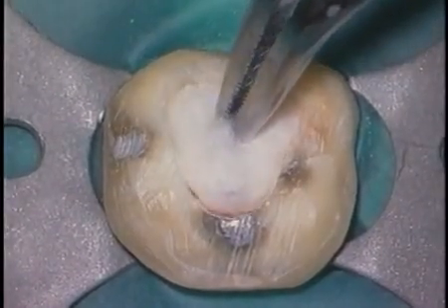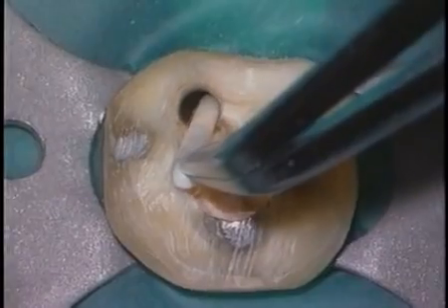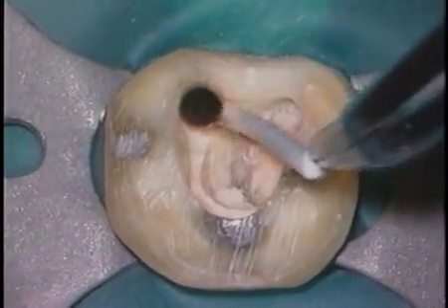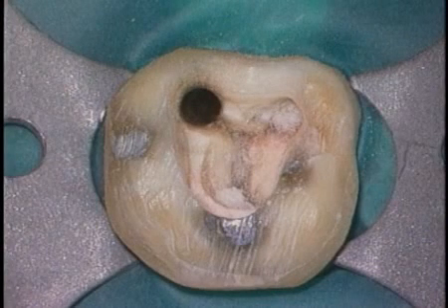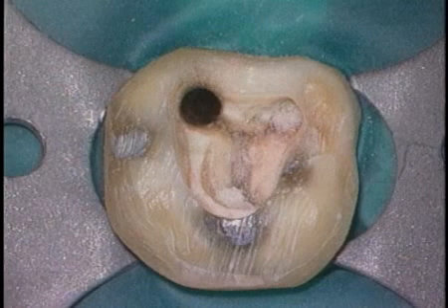We can remove the pulp chamber cotton pellet. We can remove the paper point from the MB system, and then we can remove the piece of colotape or colocoat that we had apical to the perf defect so that we have access to the canal for cleaning and shaping and cone fit procedures. This will allow us to pack in 3 dimensions.